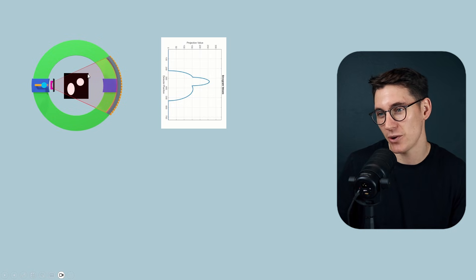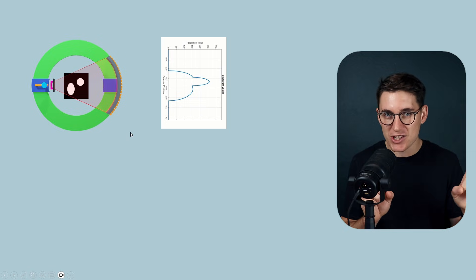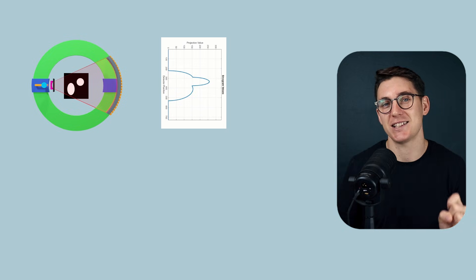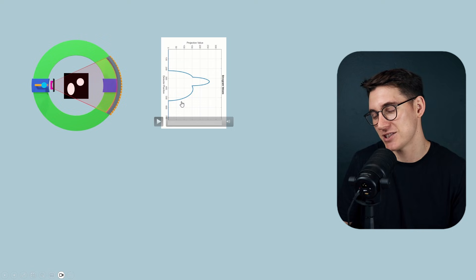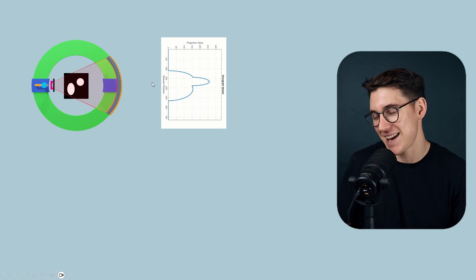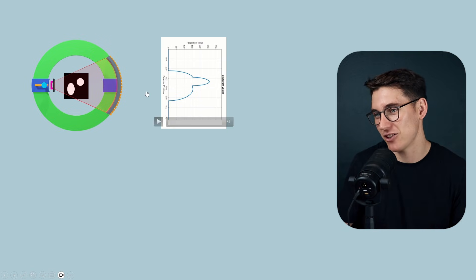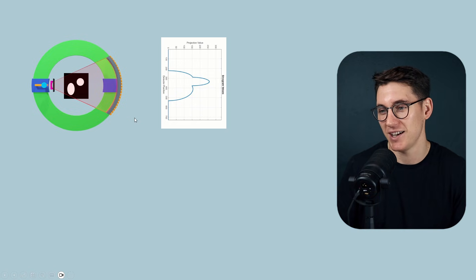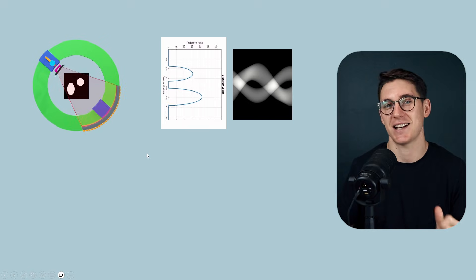Now we can change the angle of the incident x-rays as the CT machine rotates and see how that data changes. At certain angles, x-rays pass between the two objects, creating two separate regions of attenuation on the graph. The x-axis on the graph represents the detector. We can digitize these analog values and plot them over time on something known as a sinogram. Let's watch one rotation of the CT machine and see how the sinogram is generated.